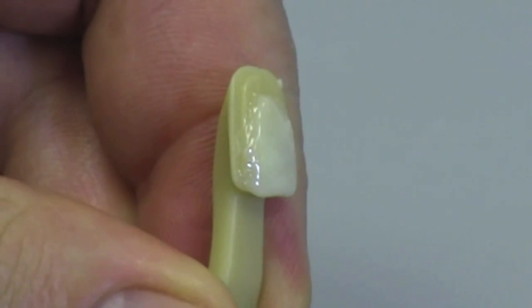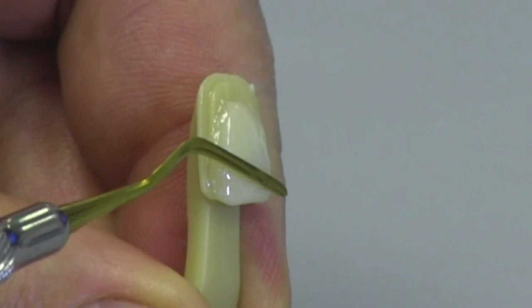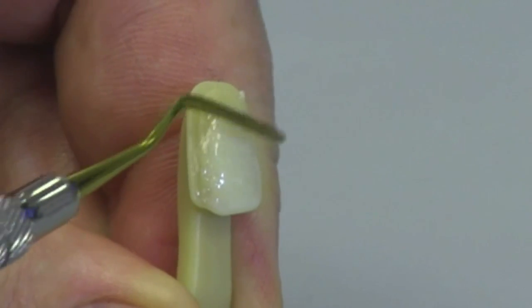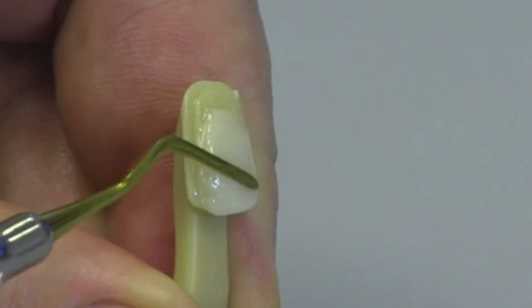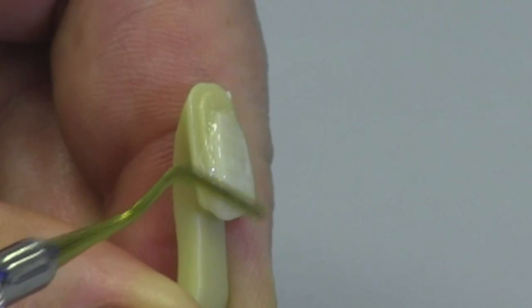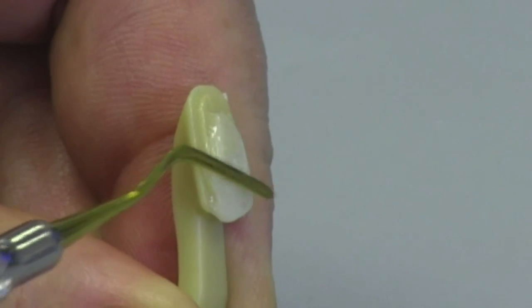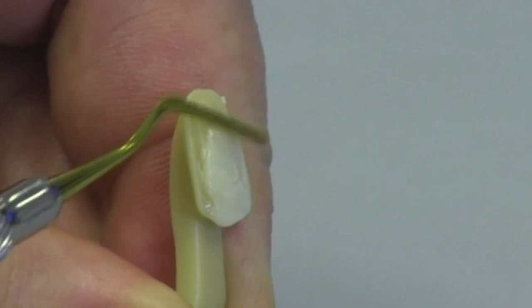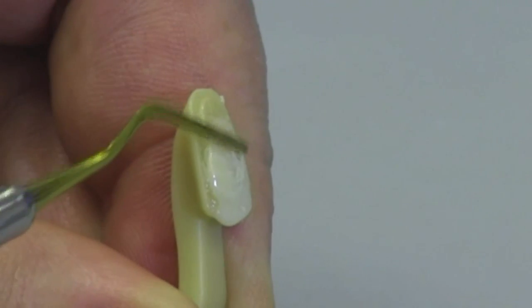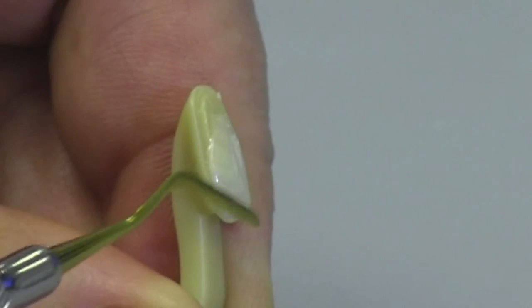If I want to pull this material over to that margin on the left side of the screen there, I can gradually do that again, being very careful not to create that material to fold over onto itself and trap air there. So very, very gently.